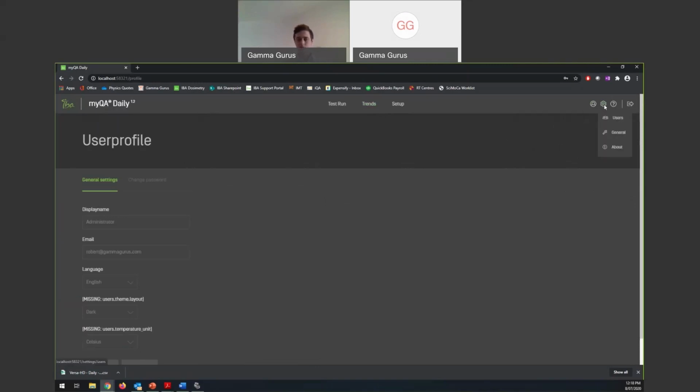There are also 3 levels of accounts. You've got your administrators, who can create tasks, run tasks, and approve everything. You've got your dosimetrists, who are only able to run the task. And you've got the physicists, who are able to run tasks and overwrite measurements.